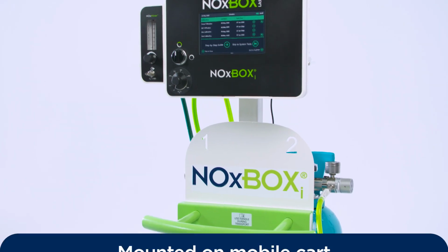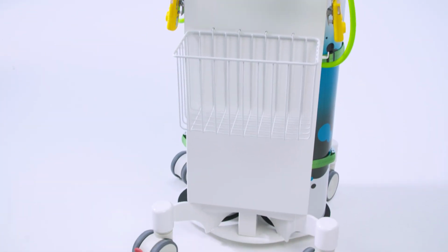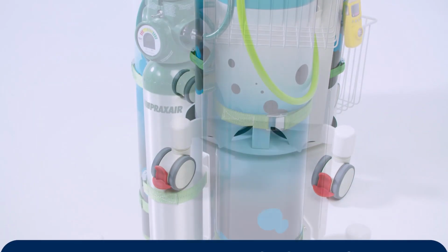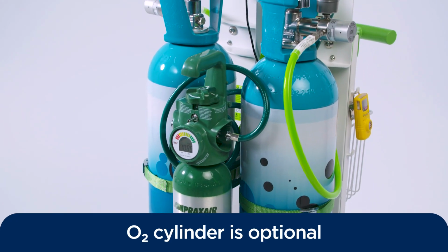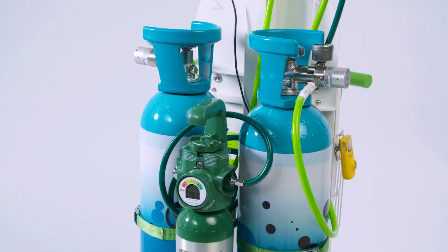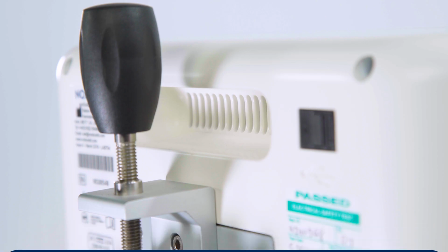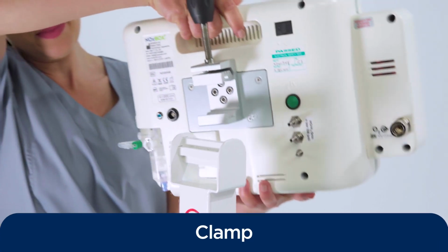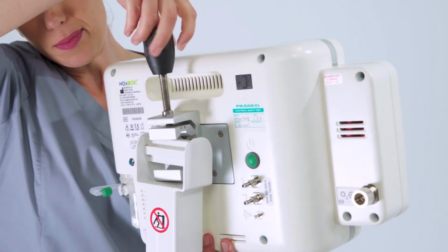The standalone device is mounted on a mobile cart for ease of use. The cart has lockable wheels, a basket, and holders for up to 2 cylinders of NOxVent nitric oxide gas. An oxygen cylinder can also be placed on the cart if a wall source of oxygen is not available. The NOxBOXi device has a convenient carrying handle, and the clamp can also be easily attached to a pole or device for use in transport situations.